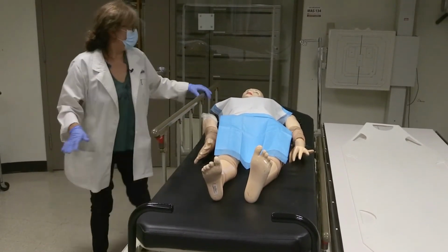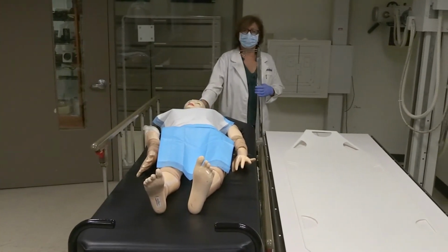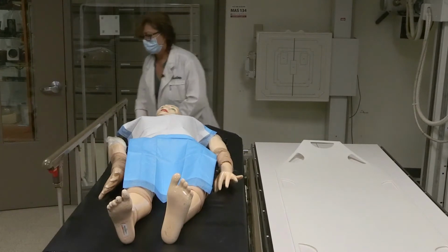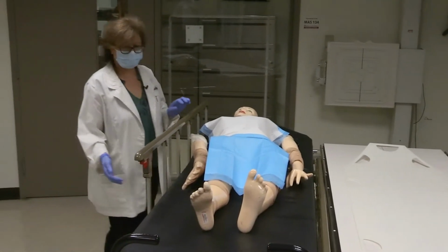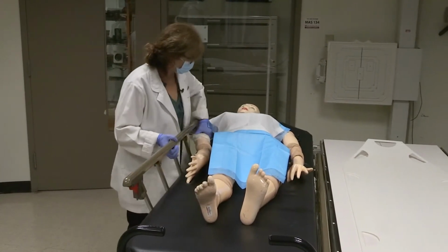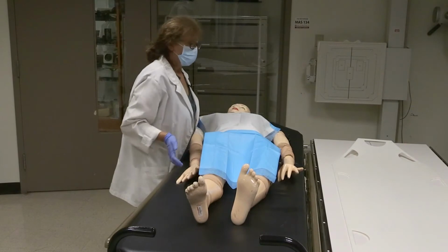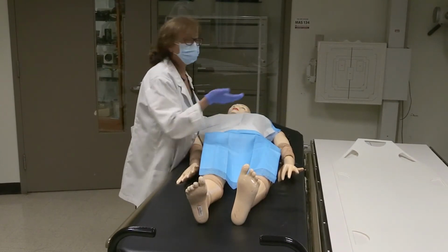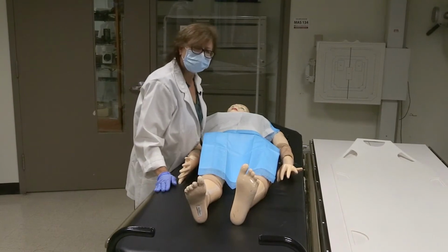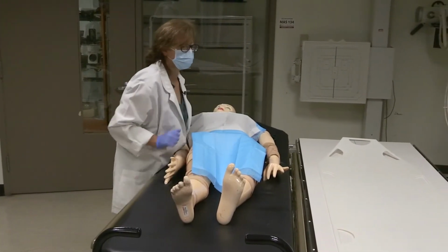And then I will stand on this side, lower my side rail, and stand by the patient's side and ask them to move. Assisting them if needed, moving their pillow if needed, but I am going to stand here just to ensure that the stretcher doesn't move back as they're moving over to the table.